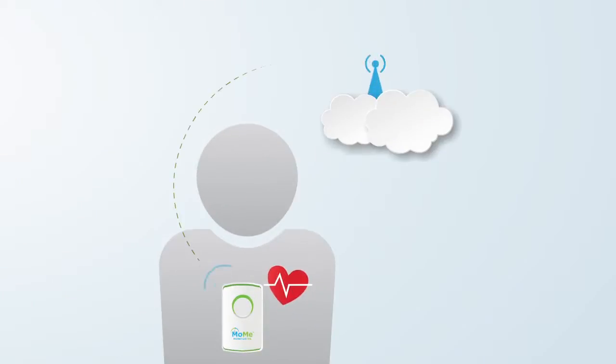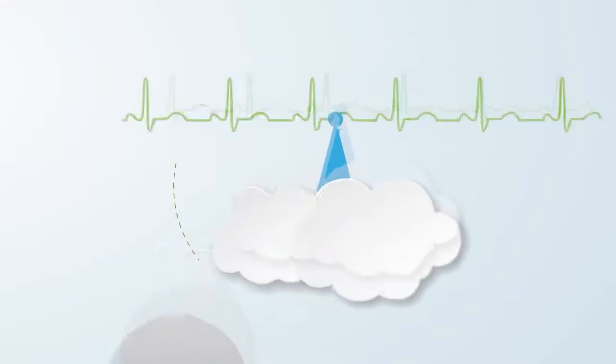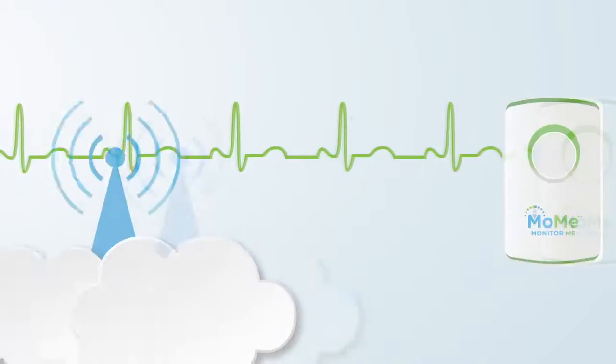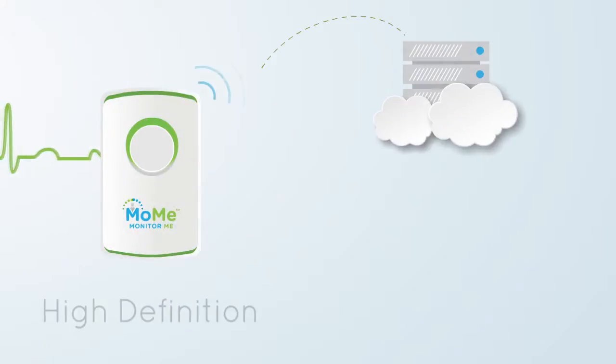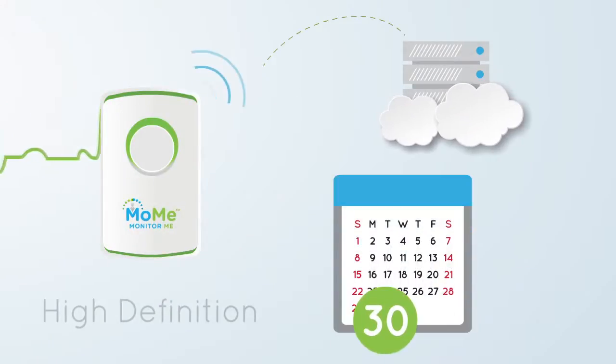The MOMI device continuously transmits a signal of the patient's rhythm through the cellular network, while retaining a high-definition copy on the device for 30 days.